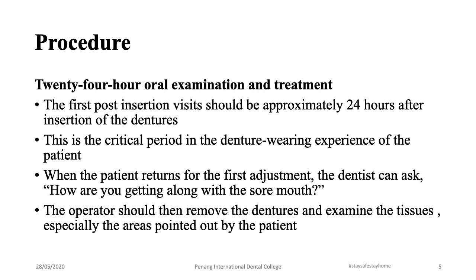Okay, so what you do is you gently ask the patient how he is getting along with the dentures, or whether he has any sore spots, and always stick to the chief complaint he gives you. If he says that he has any kind of issues, biting issues, speaking issues, sore spots, ulcers, then you always rectify that particular problem for the patient. So it is very important that you closely listen to the patient, what exact problem he is describing, and correlate them and then rectify them.